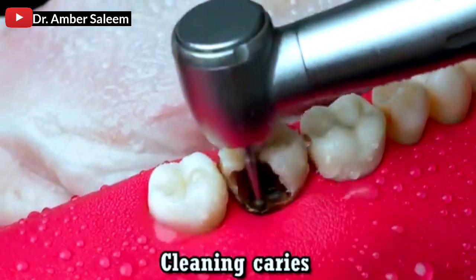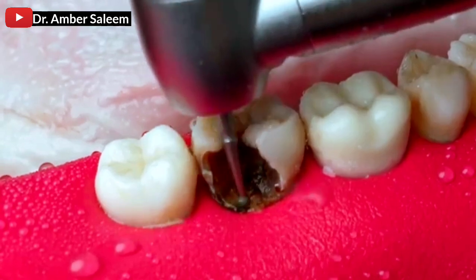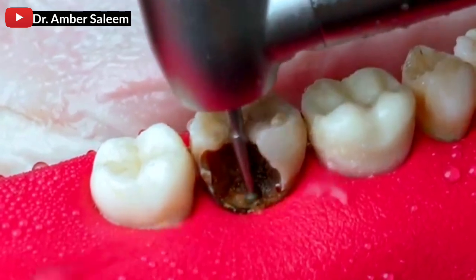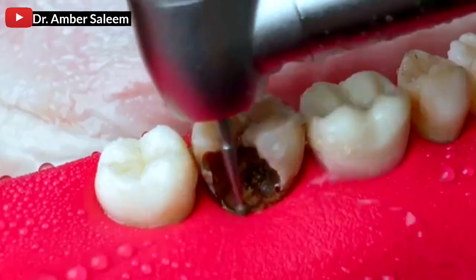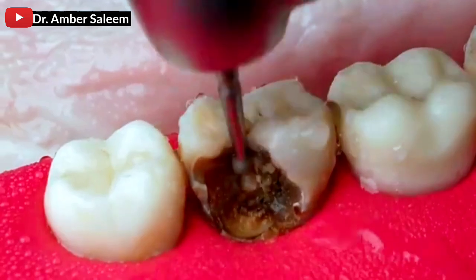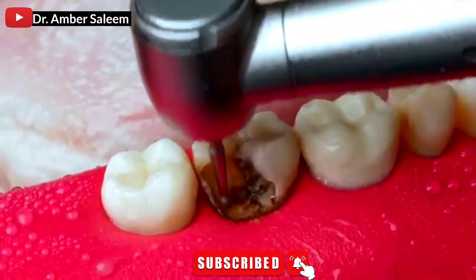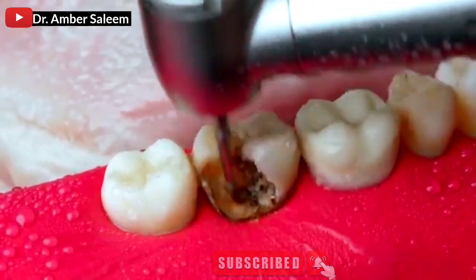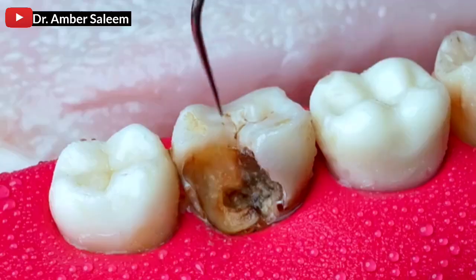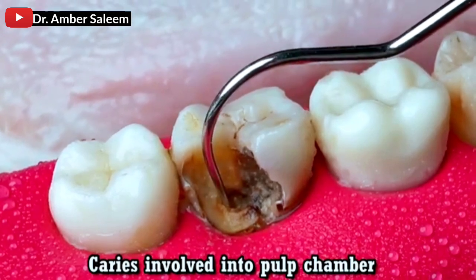Cleaning caries — removing the decay from the tooth. The caries has extended all the way to the pulp chamber.